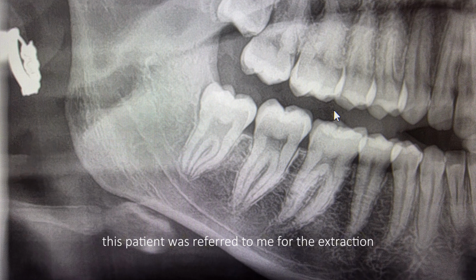This patient was referred to me for the extraction of her lower right wisdom tooth. She had suffered from multiple bouts of pericoronitis and wanted to have the tooth extracted.